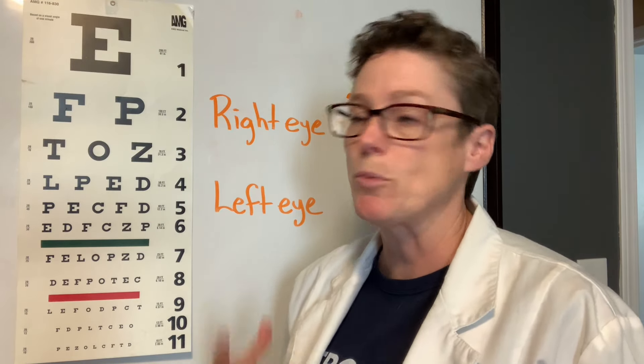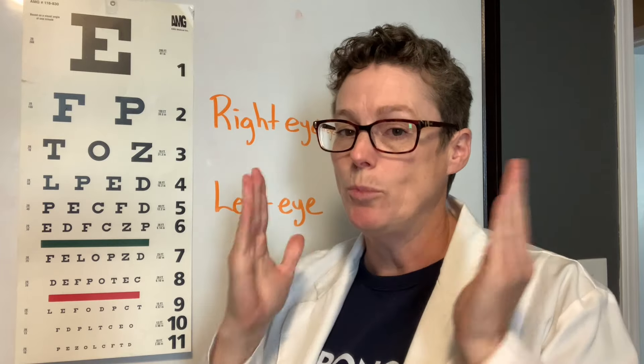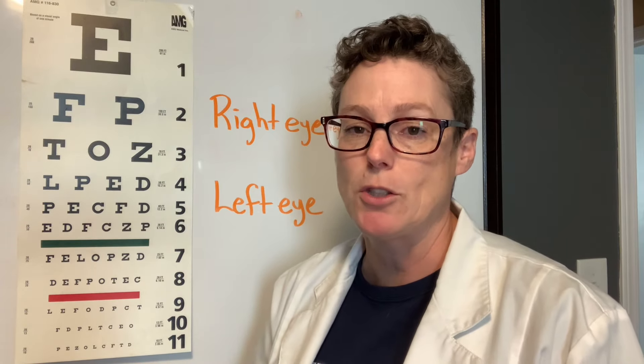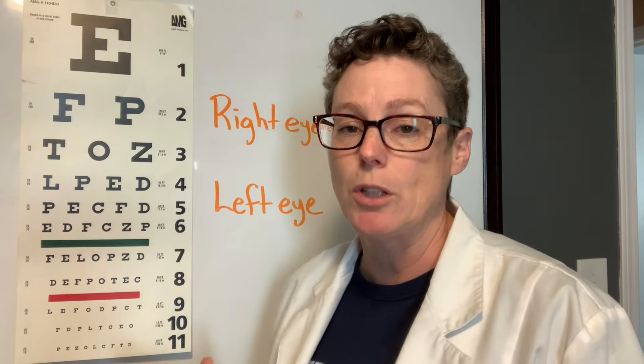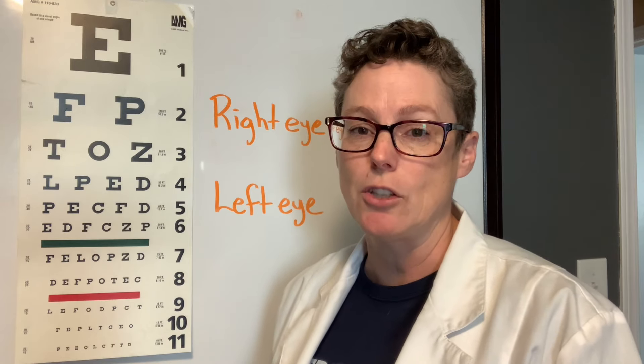Once you've done the left eye, you want to do both eyes together so you have the full picture, and that would be your visual acuity assessment done using the Snellen chart.